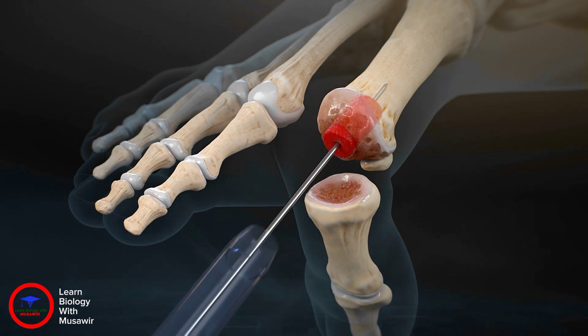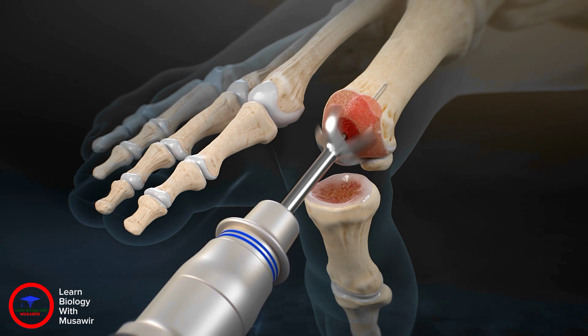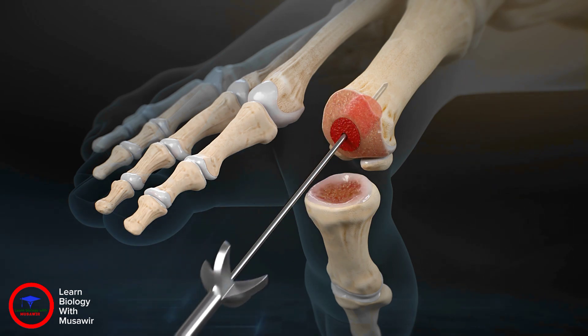Note that the bone graft may be left a few millimeters proud. Place the metatarsal reamer over the guide wire to simultaneously prepare the metatarsal head for fusion and contour the bone dowel until it is flush with the surrounding bone.